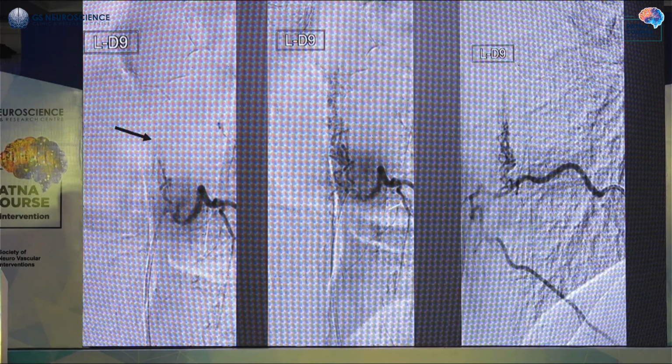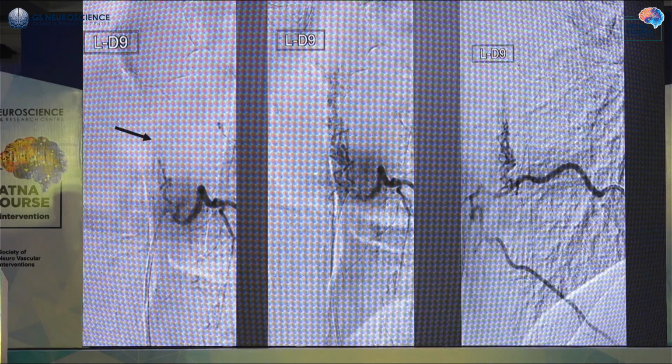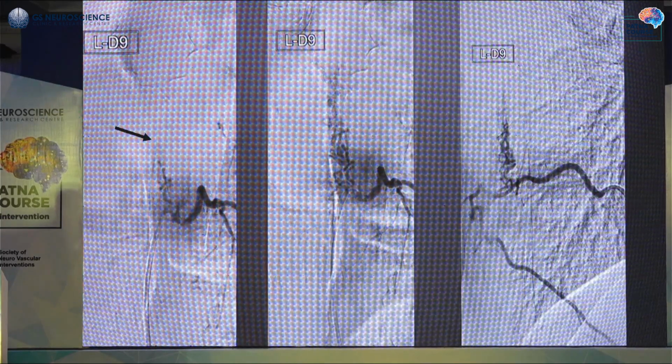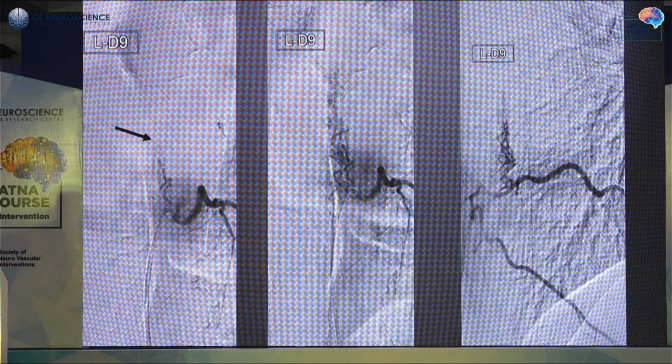So if there is a clump of vessels here, you may miss out on the anterior spinal artery. You need to watch very closely. That's why the collimation and magnified image is extremely useful. You have to inject multiple times to make sure that you don't have the radicular vessel arising from the same pedicle. And you can see the lateral view is extremely useful, and it shows you the anterior spinal arising from the same.